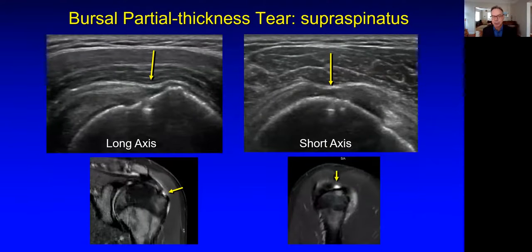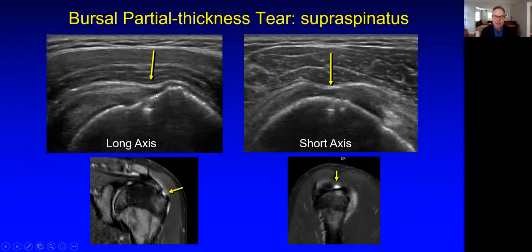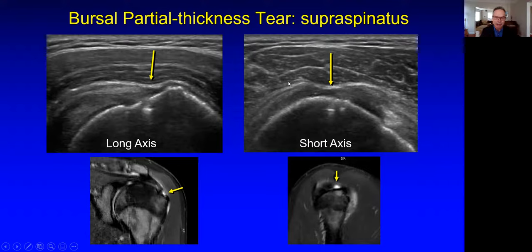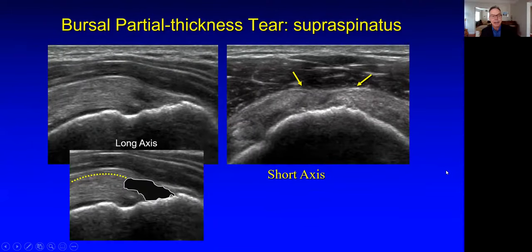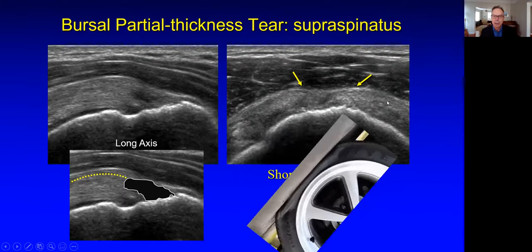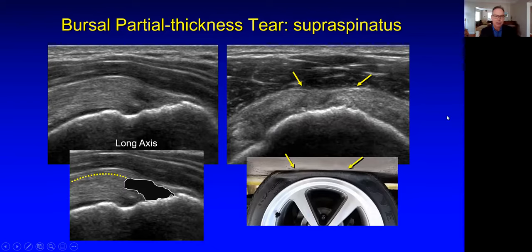Here in contrast is a bursal-sided partial thickness tear. Note the normal convex superior surface of the tendon is now concave as the deltoid dips into the torn tendon gap. This volume loss or thinning of the tendon is an important indirect sign, as is the cortical irregularity. You can really see the dipping of the deltoid. The tendon should really be like a wheel on a tire rim, but it's flattened out because of the volume loss. A companion case shows another partial thickness bursal-sided tear, emphasizing that rather than a homogeneous tendon rind going around the humeral head, we have flattening at the site of the tendon tear.